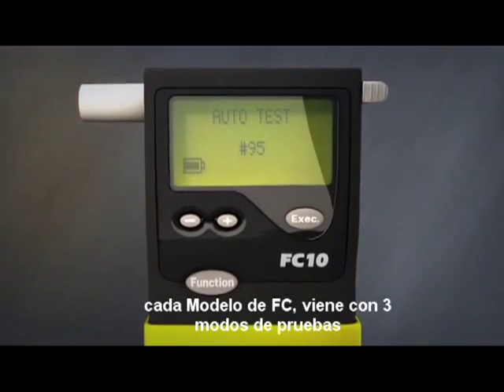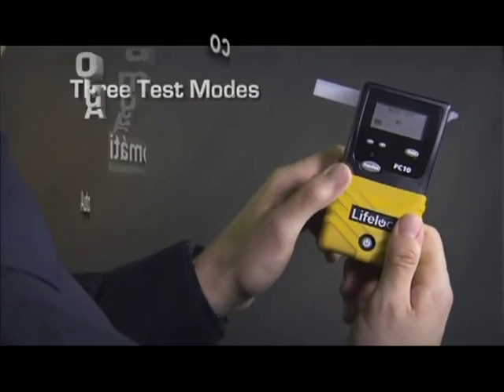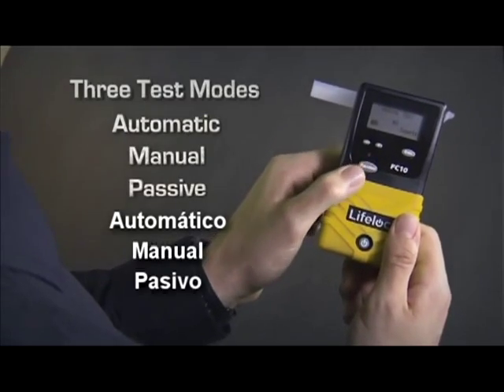Every FC model comes standard with three sampling modes to accommodate any testing situation: automatic, manual, and passive.